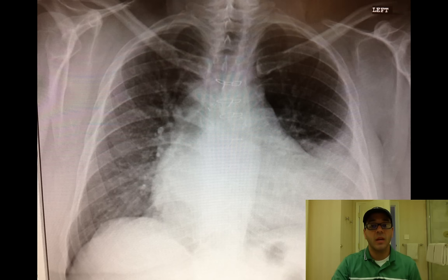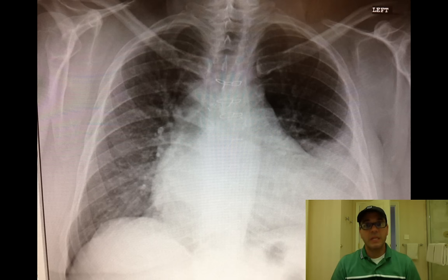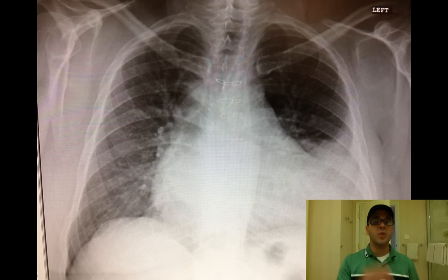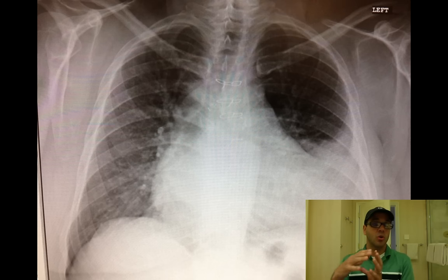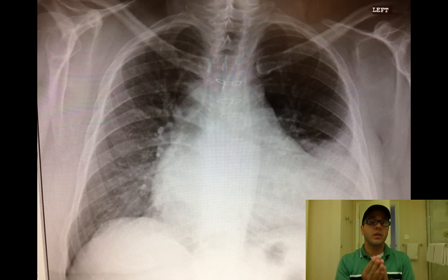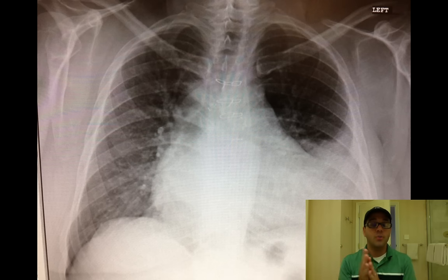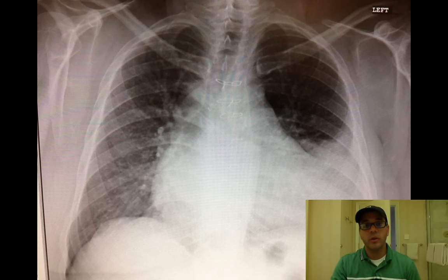Now looking at it again without the arrows and lines, you can notice right away that it looks abnormal. This is most likely a lingular infiltrate. The lingula is the middle lobe equivalent on the left side. On the right side you have three lobes — upper, lower, and middle. On the left side, because the heart takes up part of the lung space, that middle lobe becomes smaller and is called the lingula. Because the heart border gets obscured by this infiltration or pneumonia, it's called a lingular infiltrate.